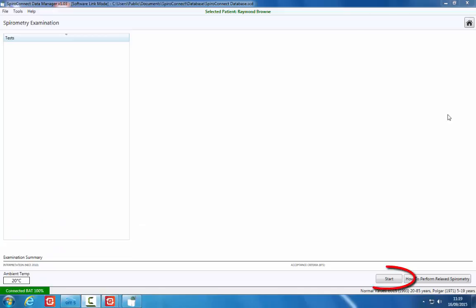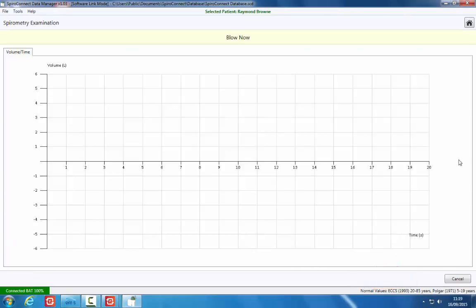Click the Start button and wait for the blue light on the spirometer to go green. A beep will also be heard from the device, indicating it is ready for the test to be performed. Pass the SpiroConnect to the patient and begin the test maneuver.